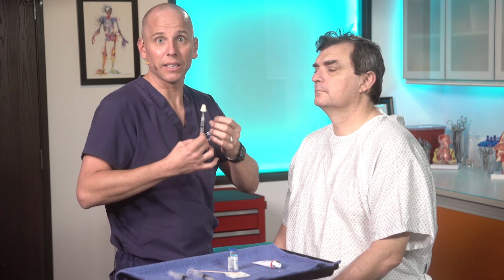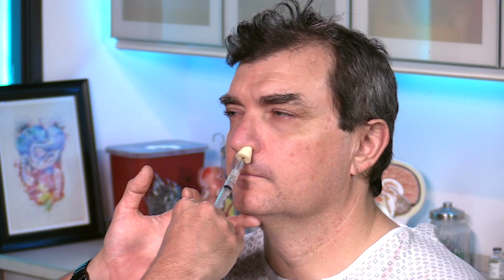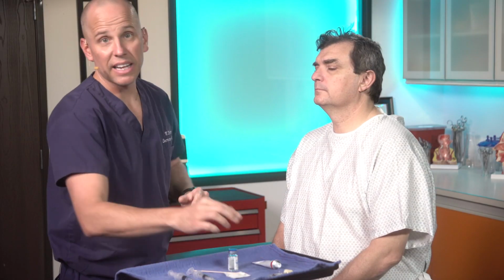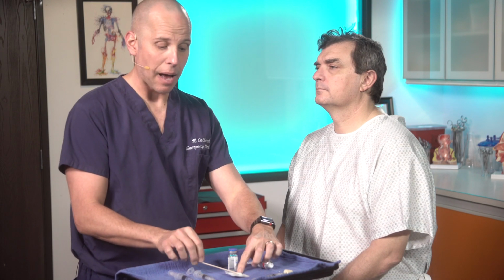And to be honest with you, I'm putting lidocaine in the same area. It's just a different form, right? It's the liquid atomized form as opposed to the viscous form. So to do that, we have our atomizer, and I'll just say, go ahead and sniff back, and I'll atomize, let it sit. I'll let that sit for about 5 minutes, and then come back and move on to the next step. The next step is going to be using our 4% viscous lidocaine and the cotton tip applicator.